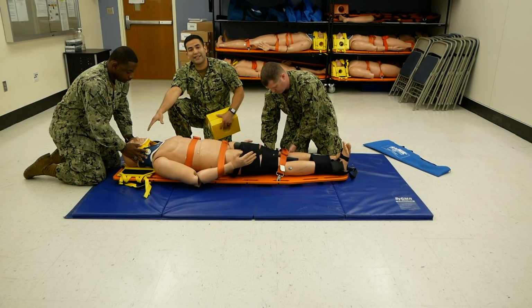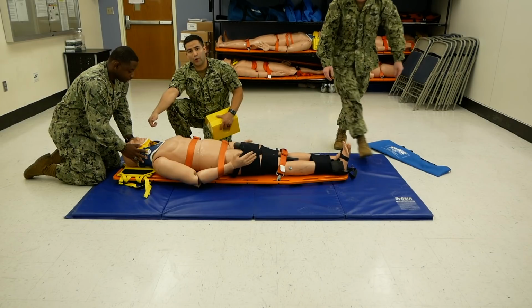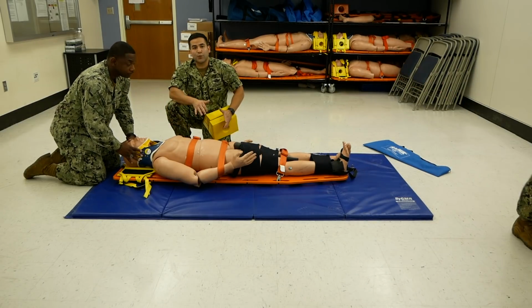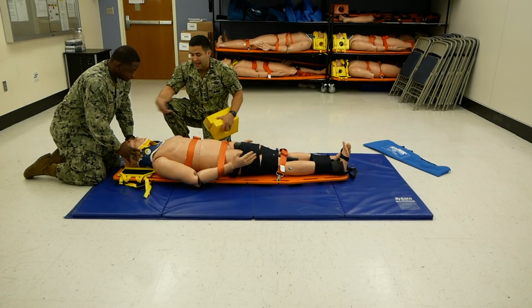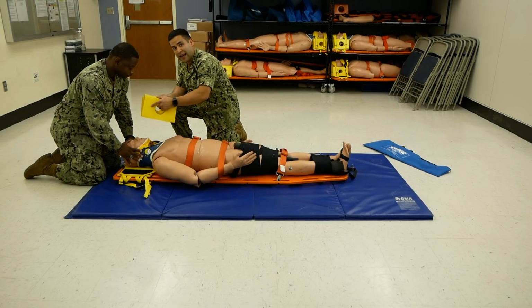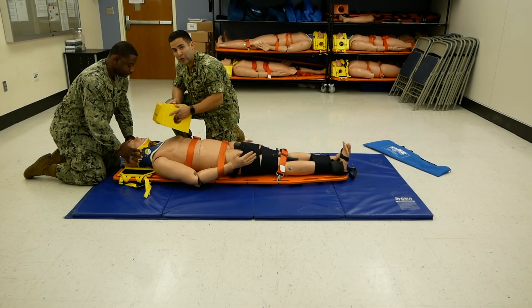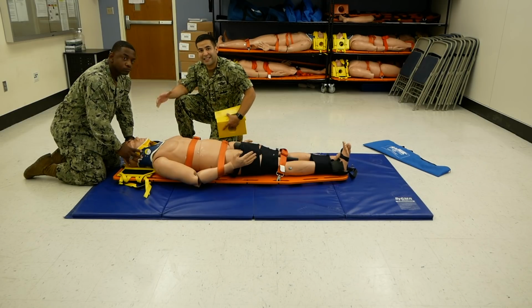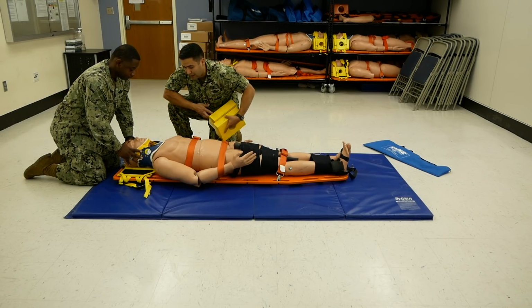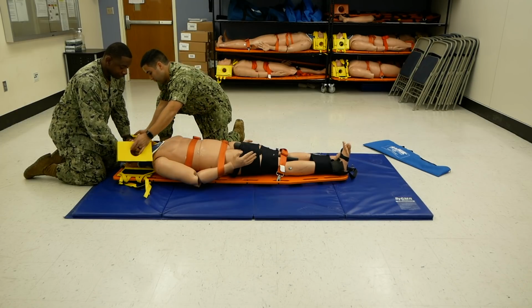Ask your assistant holding C-spine stabilization to place their thumb on the patient's forehead. Their hands will open up, and I will slide the head blocks, pressing firmly against the traps and as close to the head as possible, and securing on that Velcro. Once I have done so, the assistant holding C-spine will grab the head blocks and keep the thumbs on the forehead, still applying that manual C-spine stabilization. On your count, 1, 2, 3.